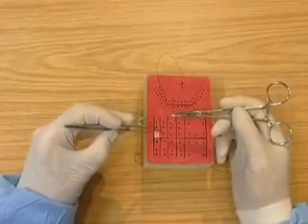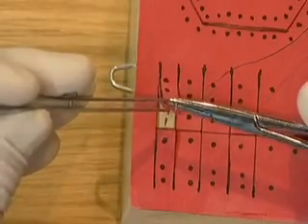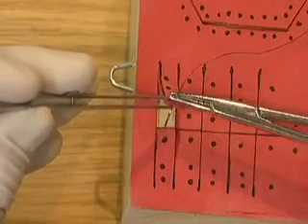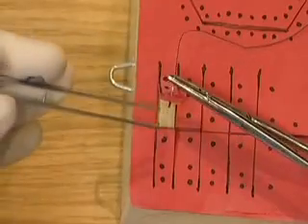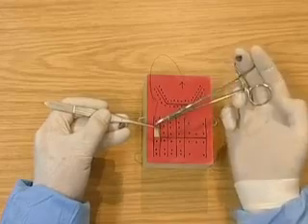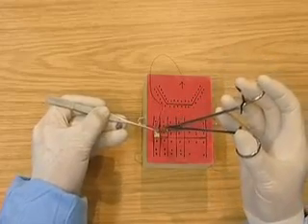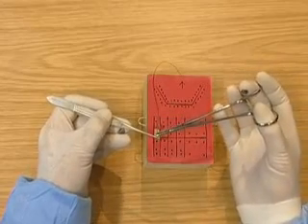Pick up the flap with the tissue pickups. Insert the needle. Take the needle with the tissue pickups. Pass to the needle holders.